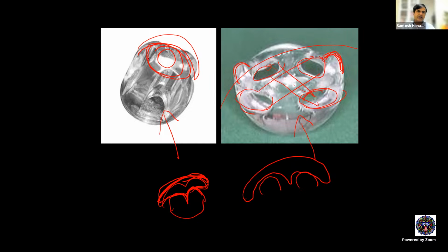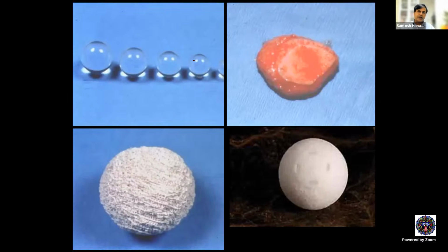They're mechanically integrated by tying the extraocular muscles to these fenestrations, and they're also mechanically integrated with the prosthesis. But the implant is already exposed, primarily by the surgeon himself, right? Which leads to infection, chronic inflammation. Infection leads to contracted socket. So all these implants are historical and they are avoided.